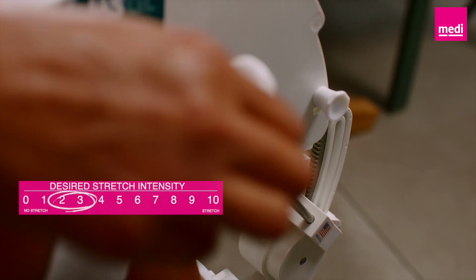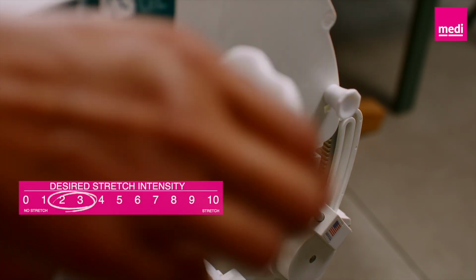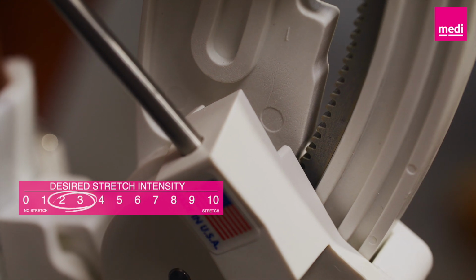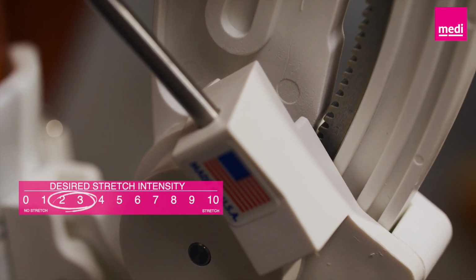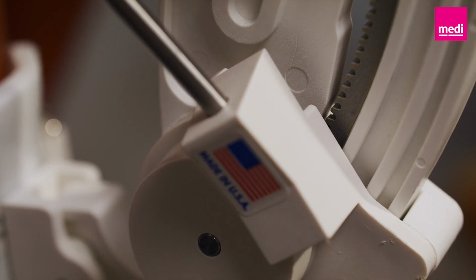Never push yourself to a painful stretch. This won't help you improve faster, and it could affect your JAS therapy results. Once you've found your pain-free stretch level, you're now ready to begin your treatment.